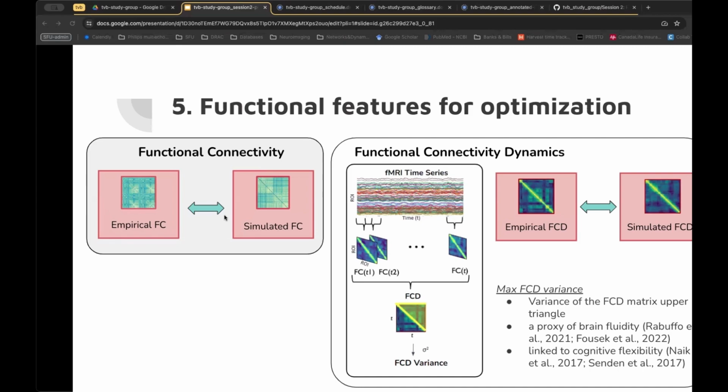And of course, the implicit part that we haven't said out loud yet is obviously the parcellation for these functional data matches the parcellation for the structural data, right? And that really is probably the only tricky part if you have two different pipelines for your fMRI and diffusion imaging. You need to try to get the two data types parcellated in the same way.